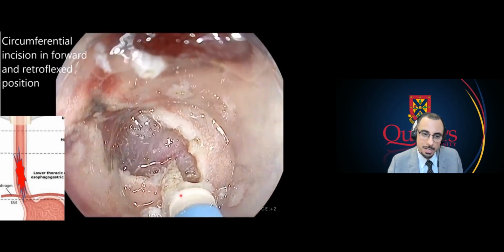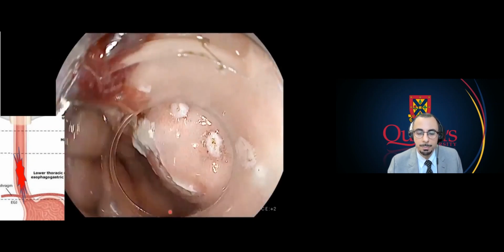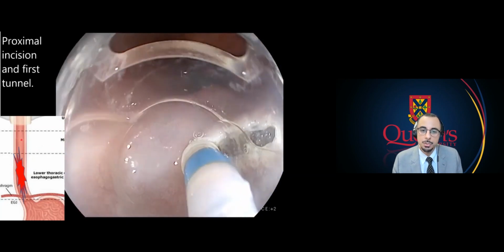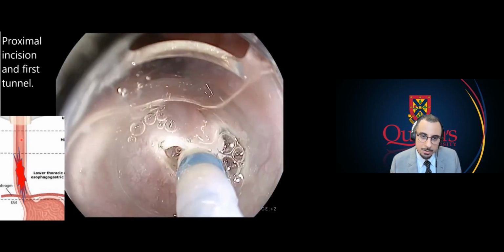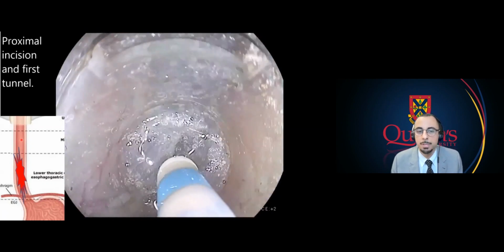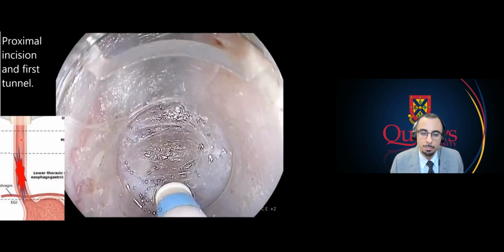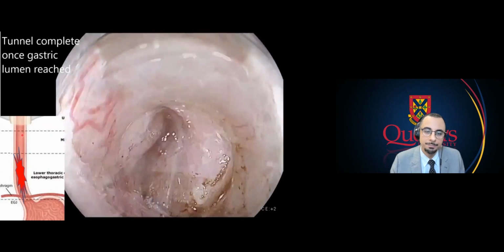So we incise that area circumferentially just below the marks, and then we come up to this area over here and make a small incision. And again, we trace it repeatedly until we can get underneath the mucosa. And finally, we get underneath the mucosa and we really just dissect the submucosal fibers, and we're peeling it off the muscularis propria. So in this particular circumstance, we did it.